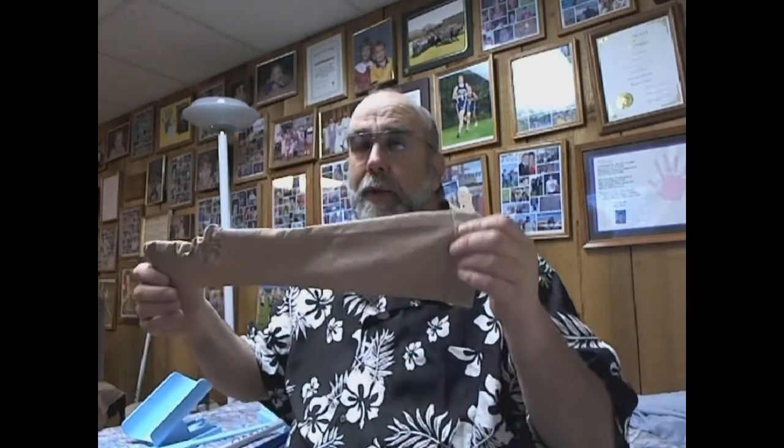The other item, and I'm going to show you how I use all these items in just a little bit. When you wake up from surgery, they put on these silly stockings.